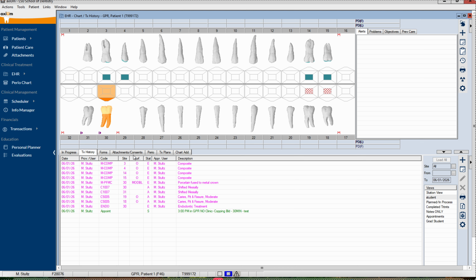What are the patient's goals for this treatment in general, like eating, aesthetics, function, just to not be in pain, to stabilize, because all of our patients have specific needs and goals that we tailor person to person. And so after we do all this, you'll go in, talk to them, and then we'll take a full set of x-rays, an FMX. Either the assistant or you will do it. It depends on who's available and what our schedule's like. We all work as a team.